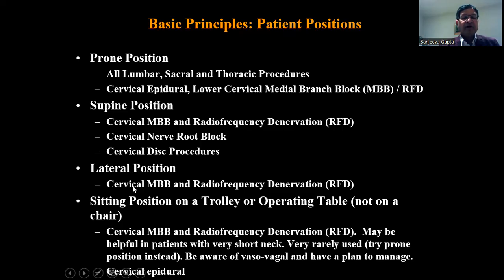Lateral position is my default position for cervical medial branch block and radiofrequency denervation. I have rarely used the sitting position, but one caution: if you're using a sitting position, always make sure that the patient is either on an operating table or on a trolley, never sitting on a stool. The reason being, if a patient has a vasovagal episode, which can easily occur in a sitting position, it will be difficult to lift the patient and put them on a trolley.